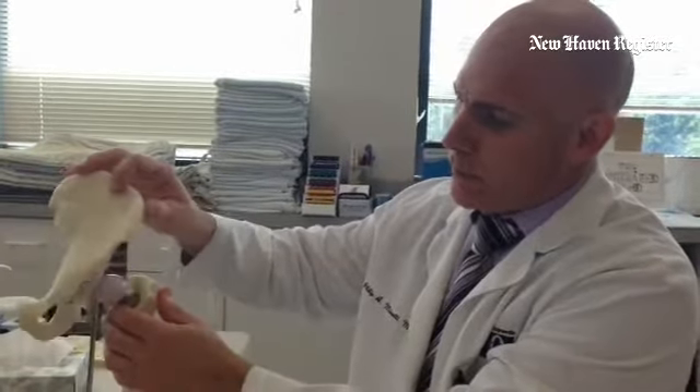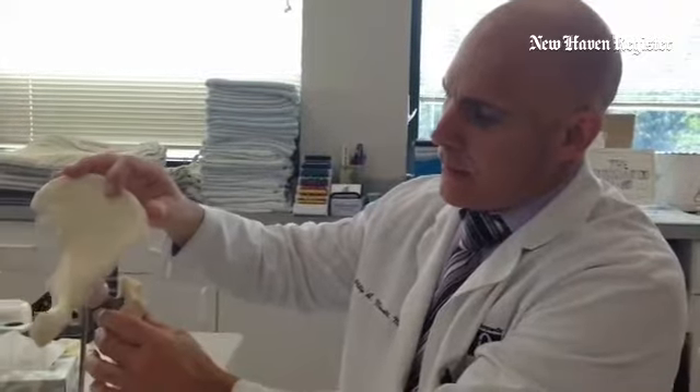This is a model of a hip replacement — the ball and the socket. The idea is how do you get these parts in here by doing the least amount of collateral damage.